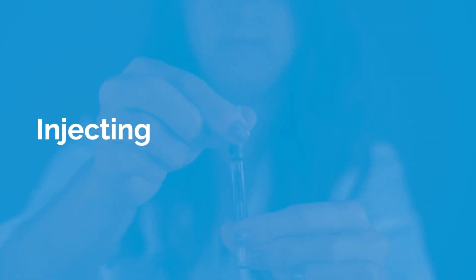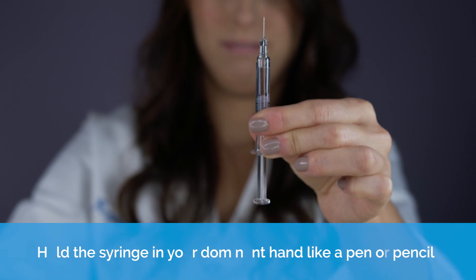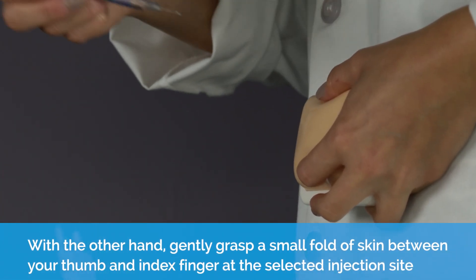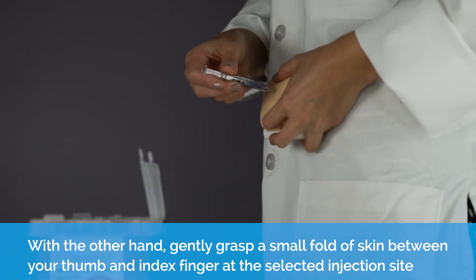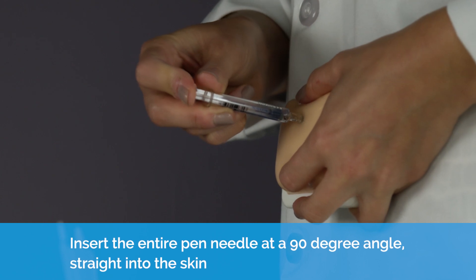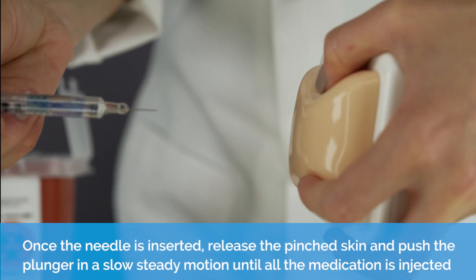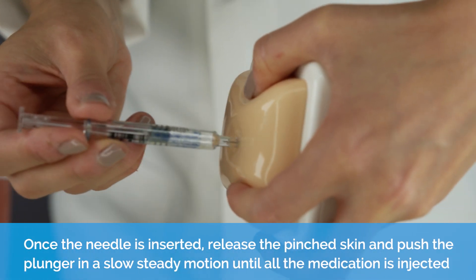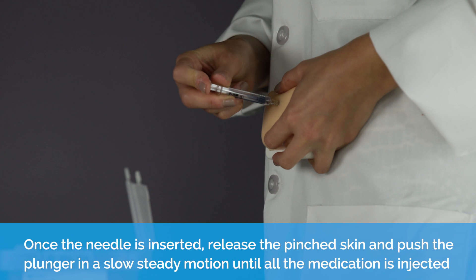Injecting. Hold the syringe in your dominant hand like a pen or pencil. With the other hand, gently grasp a small fold of skin between your thumb and index finger at the selected injection site. Insert the entire length of the needle into the fold of skin at a 90 degree angle. Once the needle is inserted, release the pinched skin and push the plunger in a slow, steady motion until all of the medication is injected.